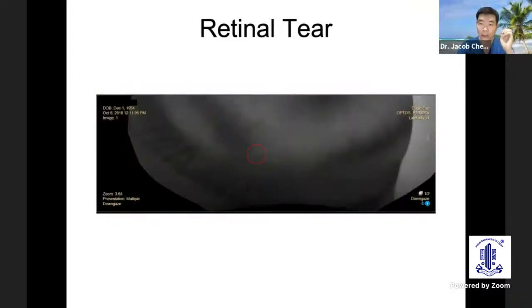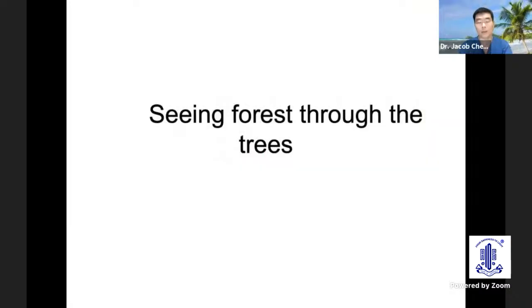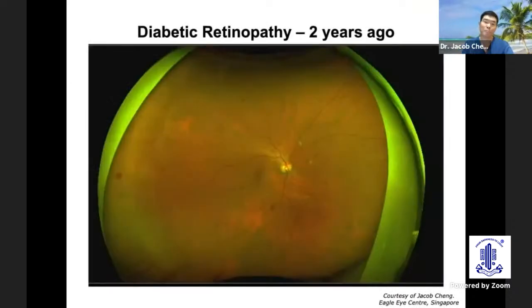Earlier speakers have also mentioned, and later on I'll emphasize also, some uses of the red and green laser or red and green channels. But here we can use the green channel to highlight the retinal pathology with the green laser. So what else can we see beyond that of ultra-wide field? Yes, we do see the forest through the trees, but sometimes you want to go back to a bit of details and not look at so much ultra-wide field. What do I mean by that?